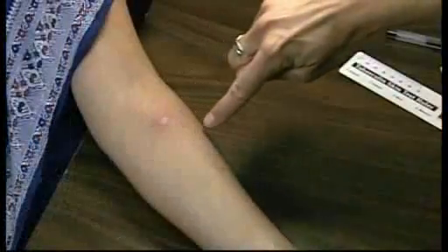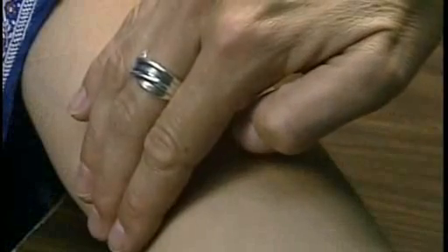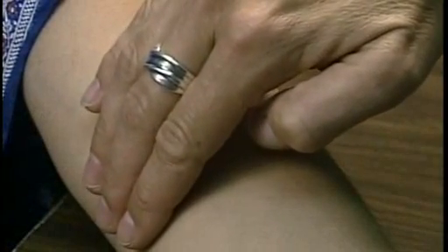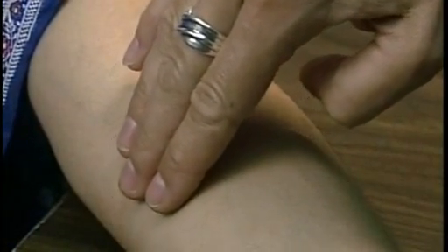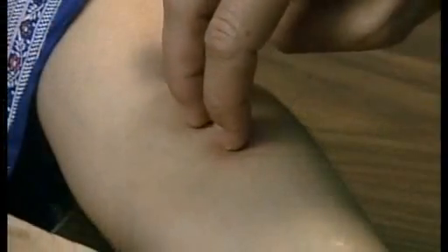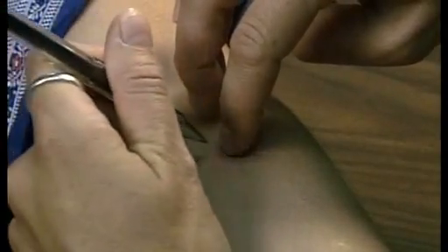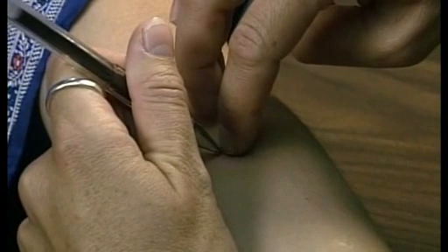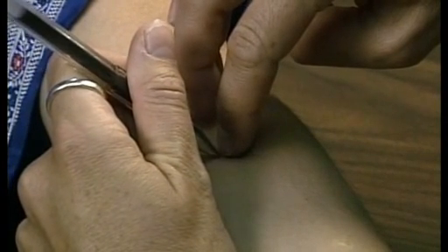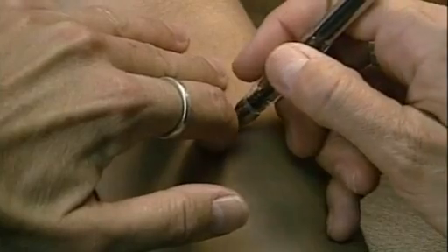The diameter of the induration is measured across the forearm. To mark the edges of the induration, move the fingertips towards the induration. Rest one fingertip firmly against the induration margin border. Mark lightly with a fine dot at the widest edge of the induration. Repeat the procedure from the other side of the patient's forearm.